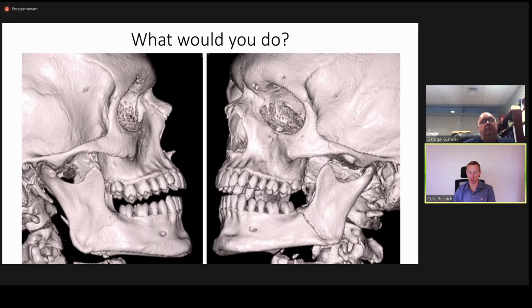I would like to have one that really controls the posterior occlusion, so I usually try to get them somewhere around between the second premolar and first molar region on each side, and then one pair in the midline. And I find that works quite well for intraoperative fracture reduction. If it's a scenario where there is a fracture in the dentate segment, let's say a symphyseal or parasymphyseal fracture, then I actually might be thinking about four screws because I really would like some screws to span the fracture itself and provide some fixation that's somewhat proximal to the fracture, as well as two more, so that means maybe two screws around the fracture itself, and then another two screws more posteriorly to control the posterior dentition. So I think that decision has a lot to do with the fracture pattern and the status of the occlusion.